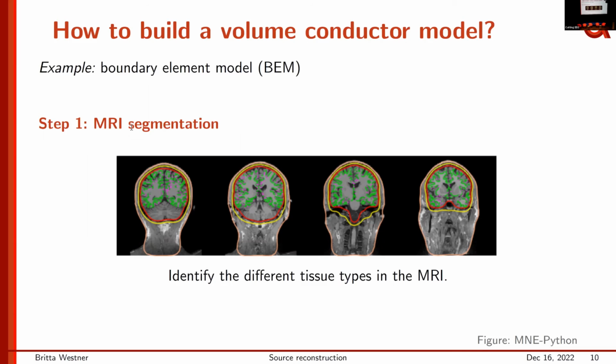When it comes to bad channels, I guess it's again one of the questions I would approach from thinking about what this channel buys you. If it's so bad that there is basically no brain activity on it, it doesn't change whether you have it in or not, I would kick it out, right? If you have a flat channel in EEG, of course you kick it out.